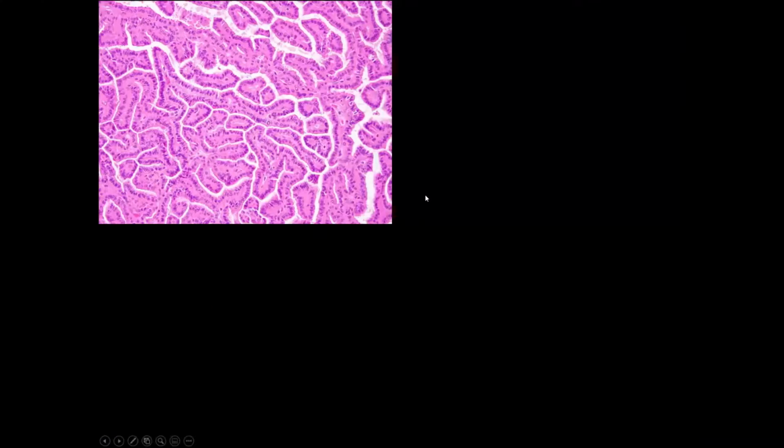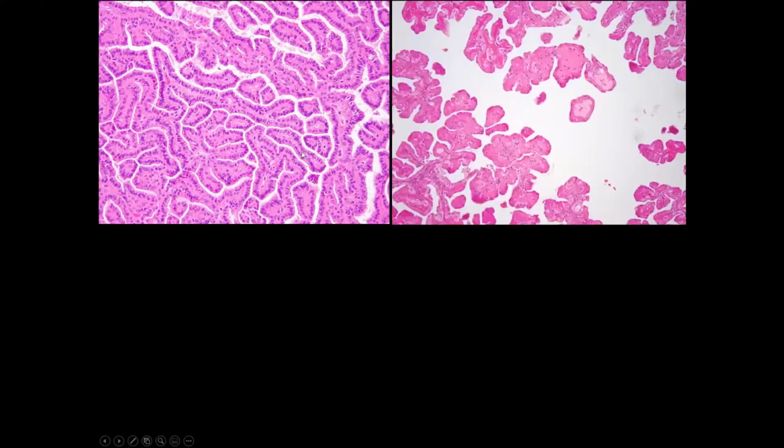Because what happens is many cases start showing this mixed or ambiguous histology. For example, here you have a tumor that looks like a type 1. It's low grade, lined by a single layer of cells, but you get more of an eosinophilic cytoplasm than amphophilic cytoplasm. There is no blue appearance here.